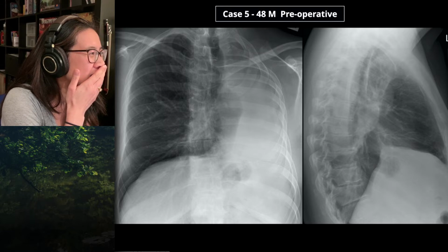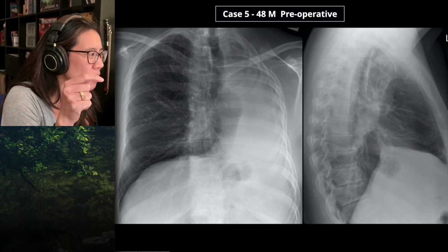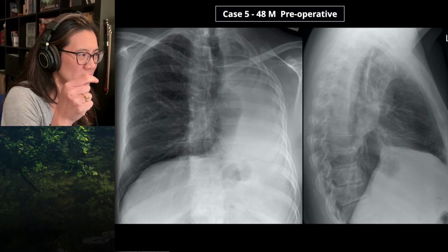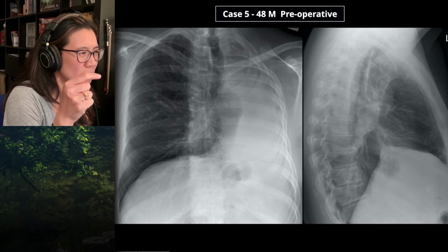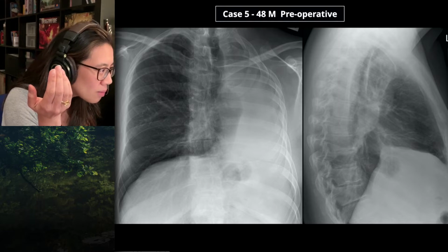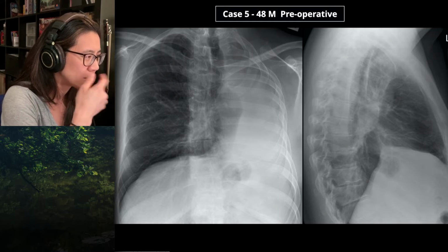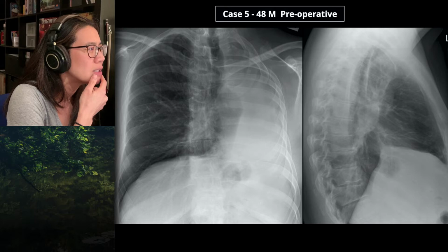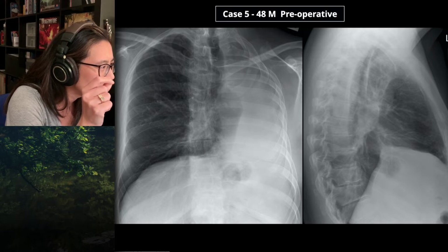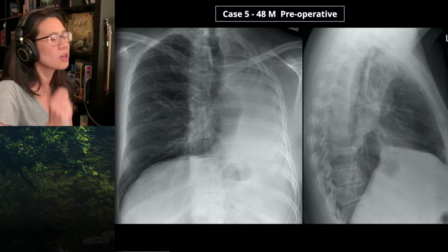Now, I'm interested by the chest wall, I have to say, because now that I look at it more, I don't think it's just the ribs that look weird. I think the clavicle doesn't look right either. The bits of the scapula that I can see look relatively normal. And the spine, I'm now looking at the spinal column because I'm wondering if there's some sort of chest wall deformity, musculoskeletal abnormality, which this patient's had forever for a congenital reason. I don't convincingly see a vertebral body anomaly, but I wouldn't worry too much about the skeleton. It's not going to help you.